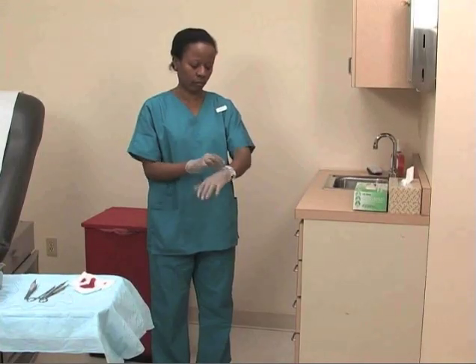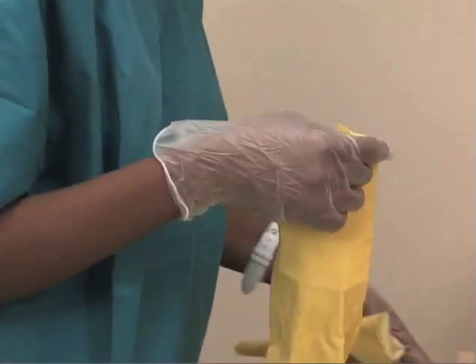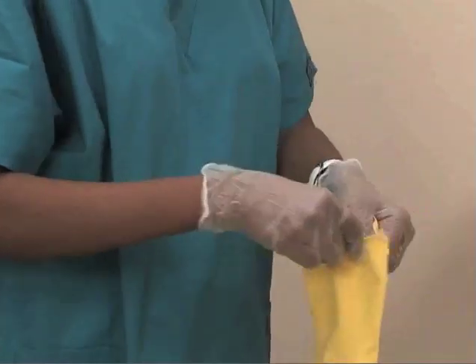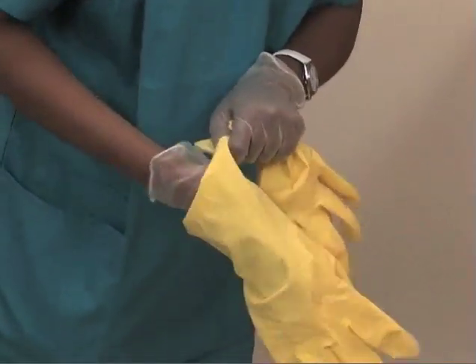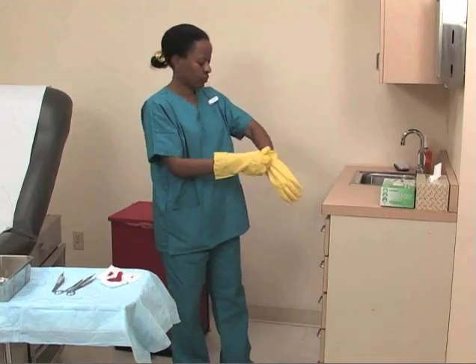Don disposable examination gloves as well as utility gloves. The disposable gloves serve as a barrier against potentially infectious materials, while the utility gloves protect the skin from the irritating chemicals used for sanitization.